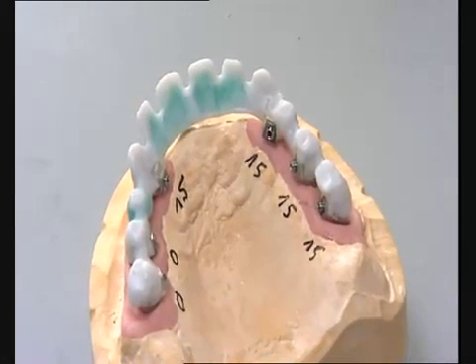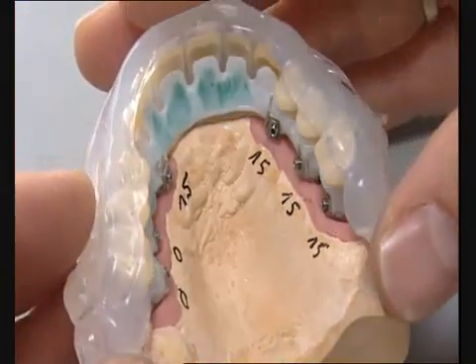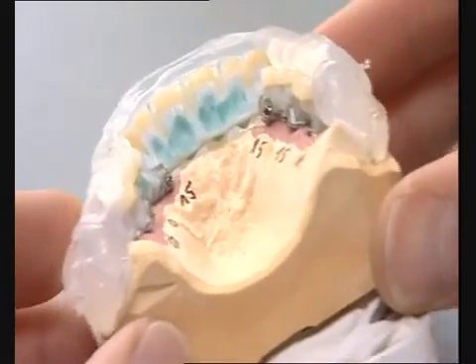The position of the veneers established by the aesthetic try-in also ensures that the dimensions of the framework pattern are optimal and that they meet the aesthetic and phonic requirements of the patient.